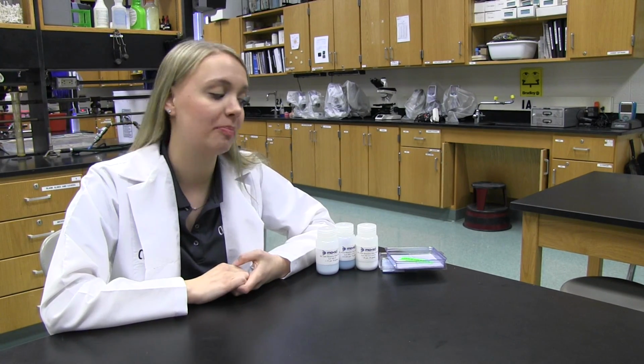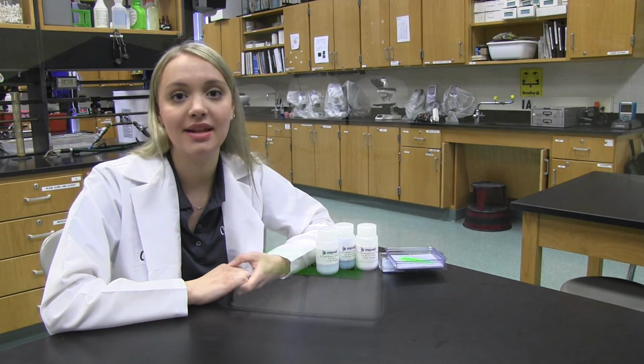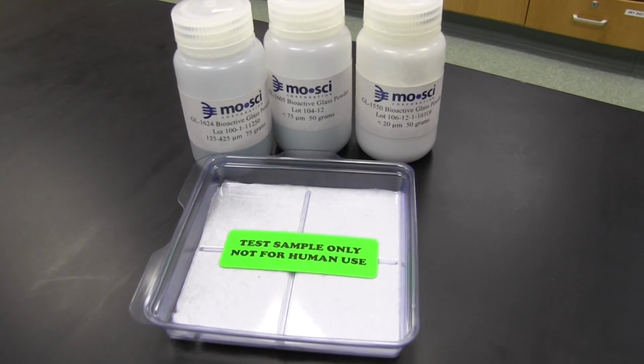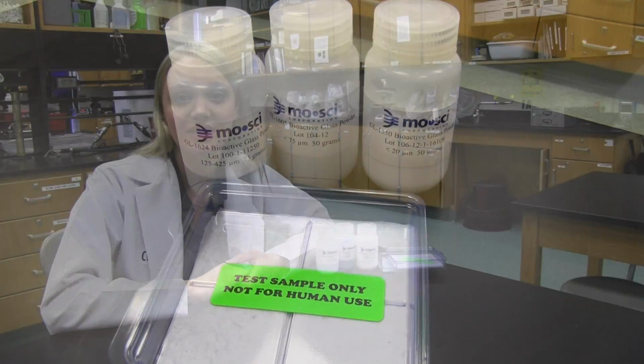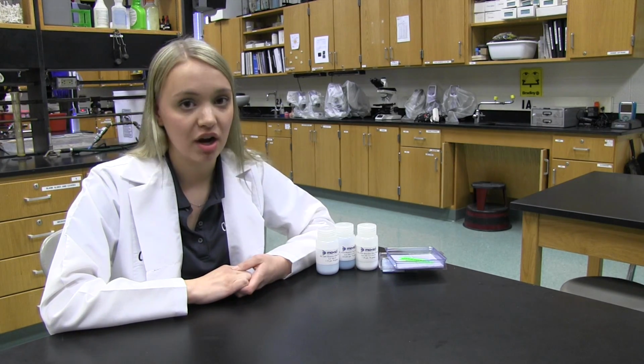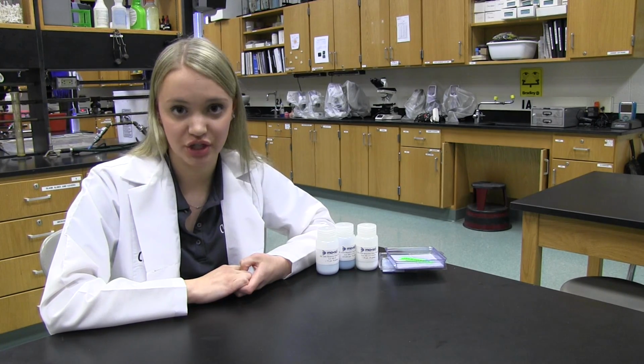So for this research, I have mainly been working with a product called bioactive glass, and it is a product made of high purity chemicals found naturally in your body, and there are many different types of it. We worked specifically with borate-based bioactive glass. So there are three things that bioactive glass does. It is extremely absorbent, it is extremely sterile, and it heals cells where there is damaged tissue.